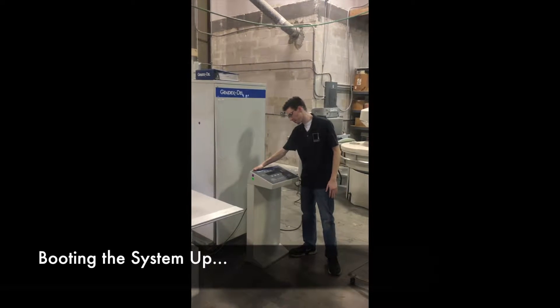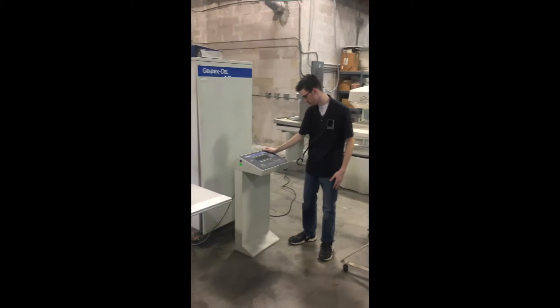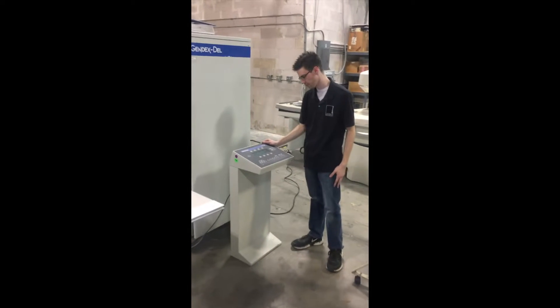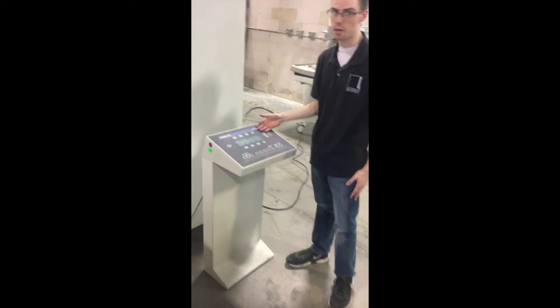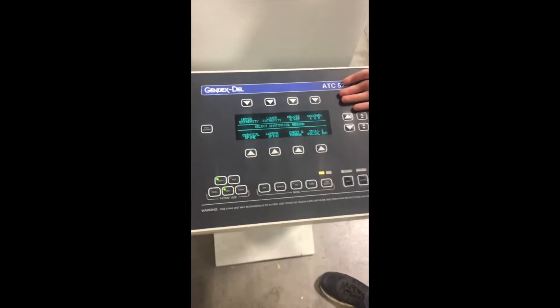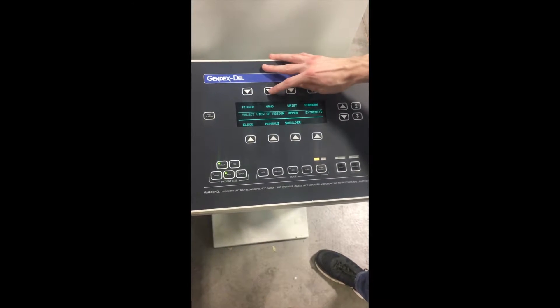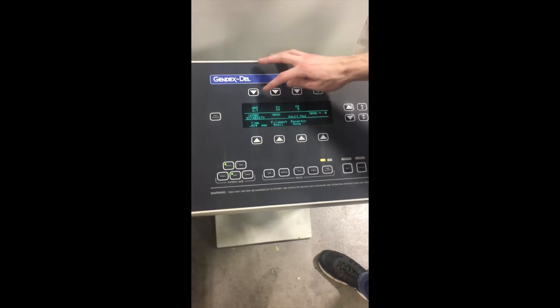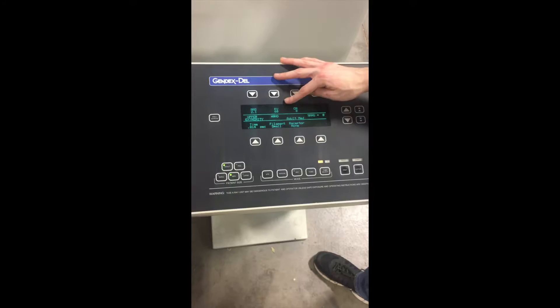You're going to turn the unit on by flipping the switch on the control panel. As you can see, it has anatomical programming. You can simply select what you want to do for the procedure. So we can do upper extremity, select hand, and it will set the mAs and the kV to the levels it needs to be for that kind of procedure.